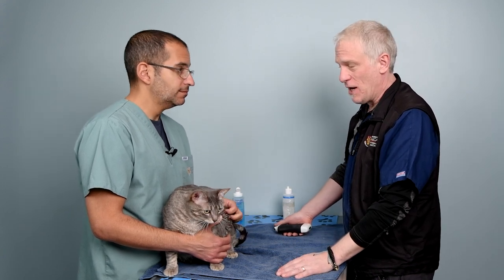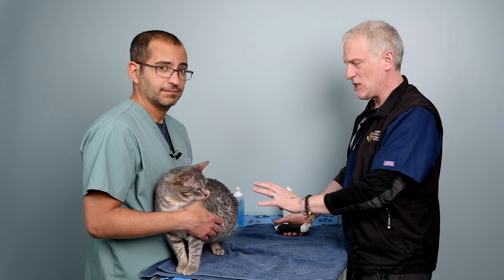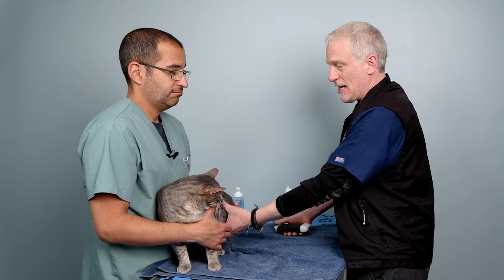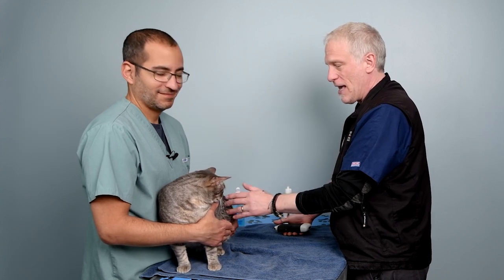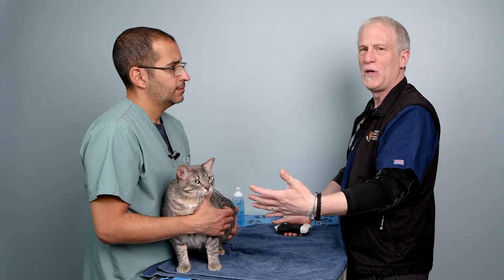One of the coolest things — I love the pleural space and lung. It has to be my favorite thing to scan, because there are so few things in the thorax that we can look for. To be able to scan the pleural space and lung, we're going to show you a quick overview on Daisy here, on how quickly we can scan the lungs. But before we do that, it's really important to know your borders — your sonographically defined borders — because looking at Daisy, I can't tell where her lung ends and her abdomen starts. We're going to quickly go over the borders that we scan, and then we'll show you how we find those and how we quickly do an overview before we break it down and go specifically into each of the pathologies we look for with our PLUS scanning.